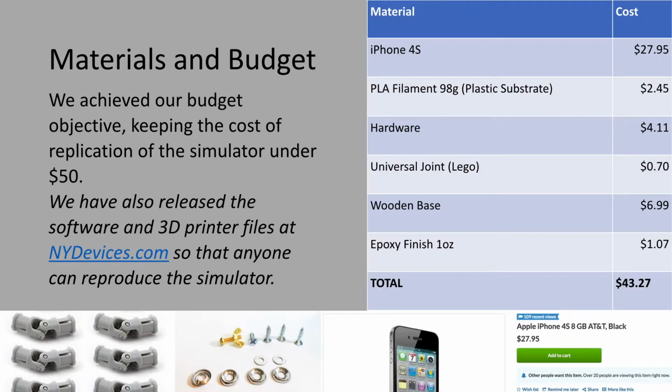We achieved our budget objective, keeping the cost of replication of the simulator under $50. We have also released the software and 3D printer files at nydevices.com so that anyone can reproduce the simulator.